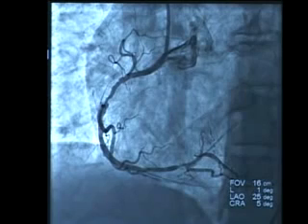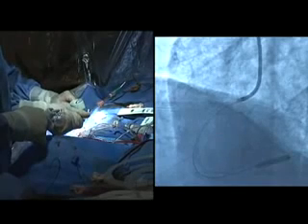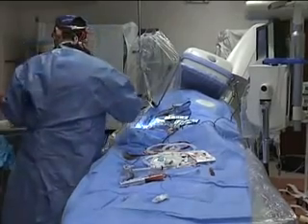Now we're going to put stents in this artery. We'll put a 3.0 distal stent just at the crux — this is a 3.0 by 15. The stent is deployed crimped on a balloon. We expand the balloon, which will leave the stent in the vessel. The balloon will then come down and the stent will remain fully expanded. Right now we are forcing the stent into the wall of the artery with a high-pressure balloon. In about 30 seconds, we'll remove the balloon and leave the stent. The first stent is placed in the distal-most part of the artery.